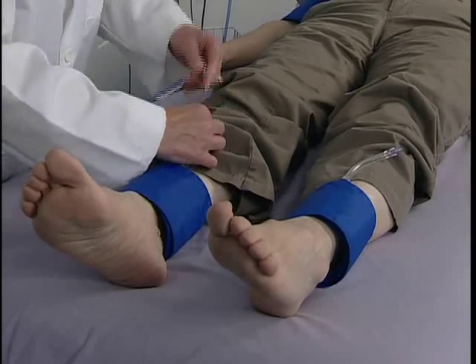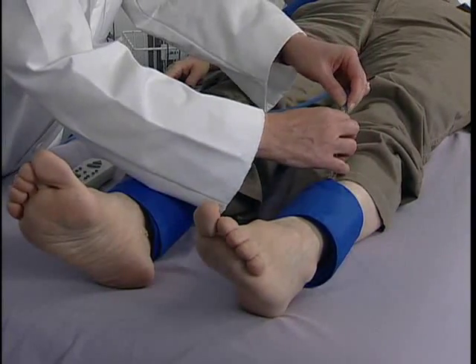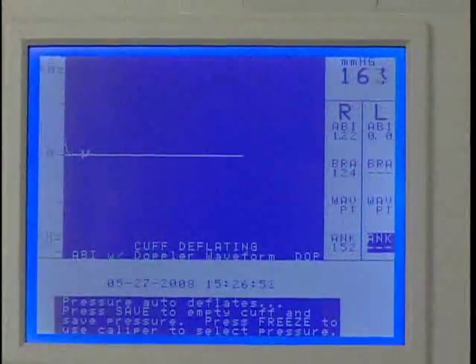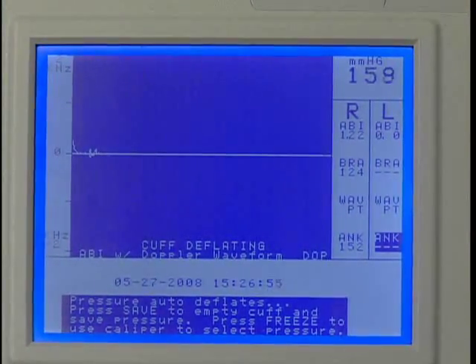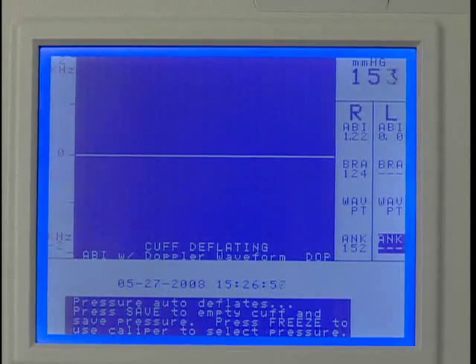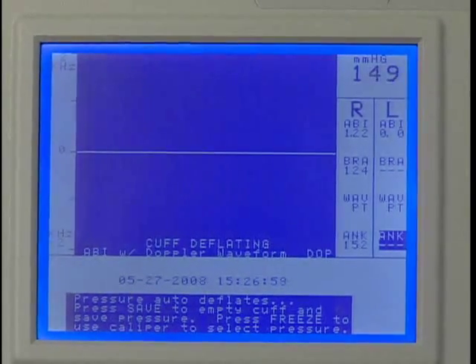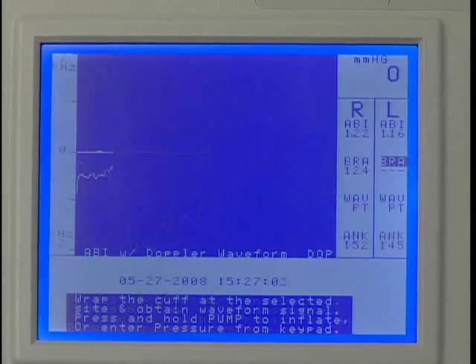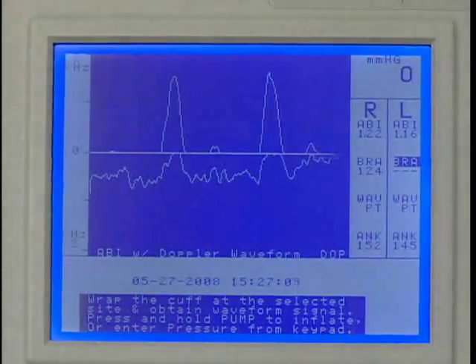Move the hose to the cuff at the left ankle and obtain the waveform as demonstrated for the right ankle. After saving, the marker will move to the next protocol location for obtaining the left ankle pressure. After obtaining and saving the left ankle pressure, the marker will move to the last location — the left brachial.